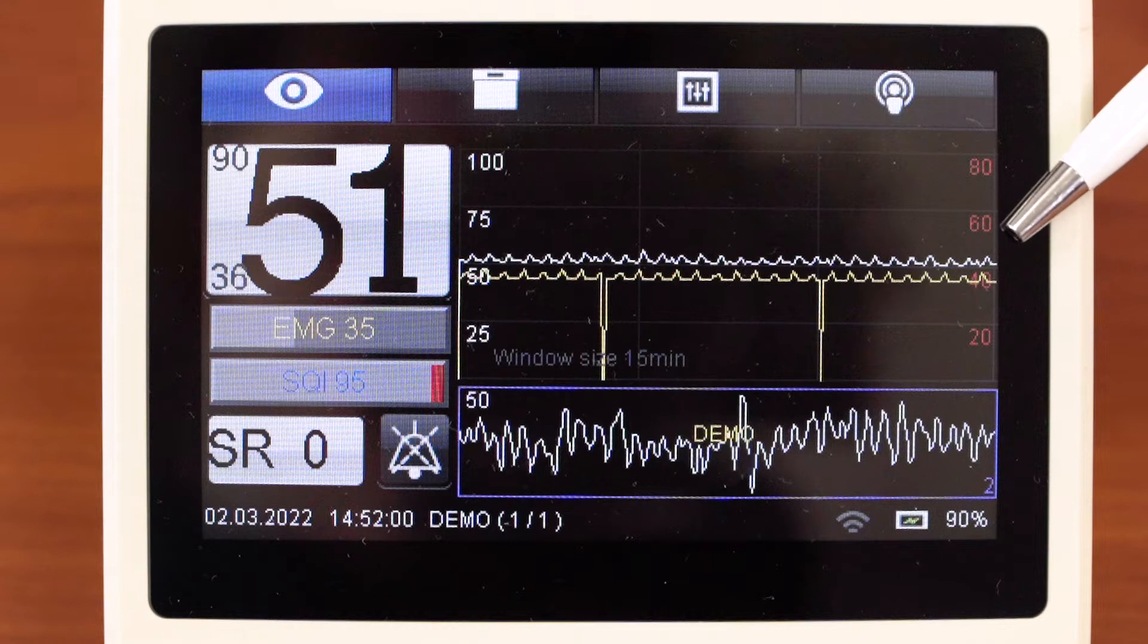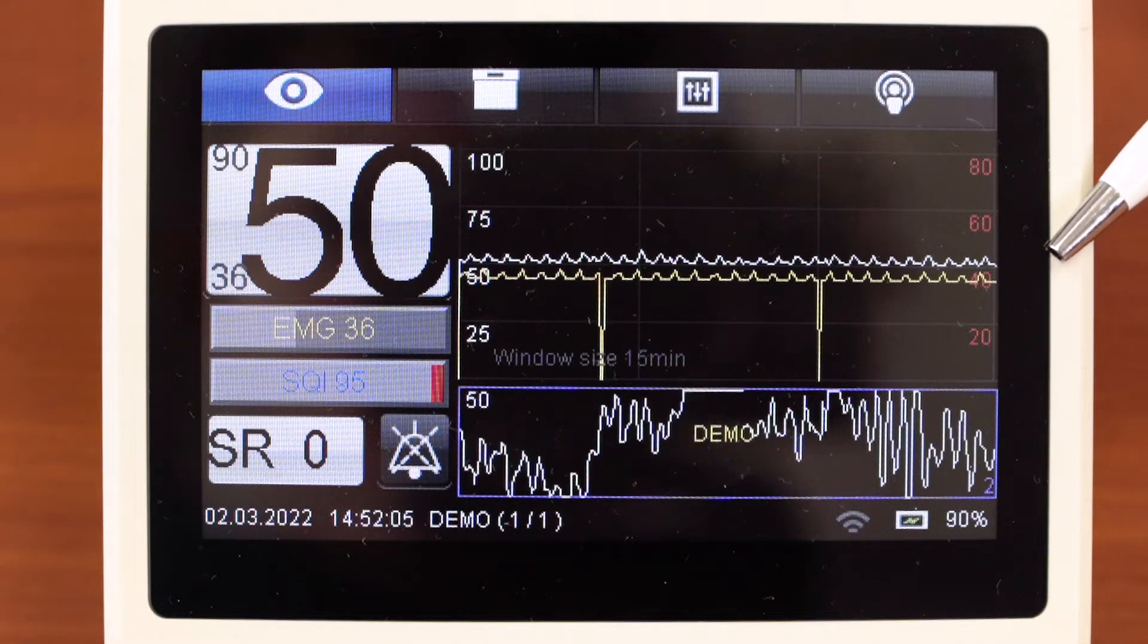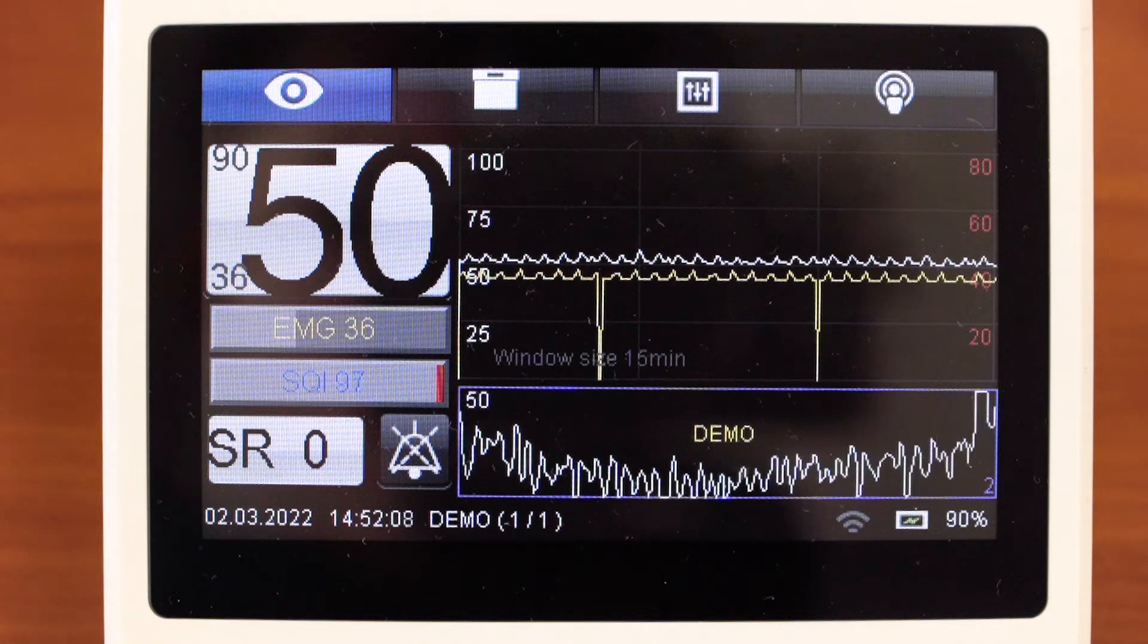There are activity index graph white and electromyography component graph yellow. We can add to the screen other graphs.